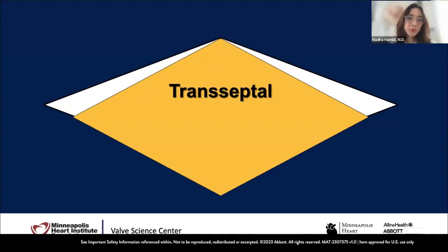Oh, that is such an important point. I do that too a lot, put the blood pressure on the screen and then discuss the case. So I know what the blood pressure is. It's easy when a patient is under general anesthesia because you can ask the anesthesia team to push the blood pressure up. But it's really hard in the outpatient setting under moderate sedation. But certainly a great point about the blood pressure for these patients.